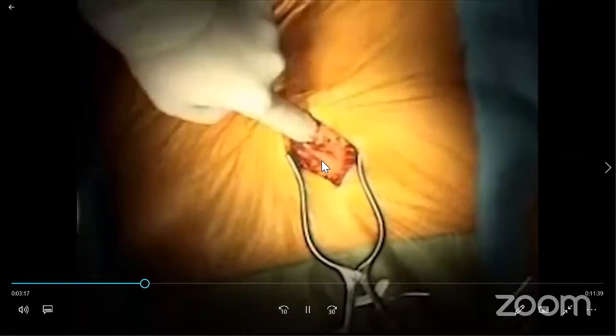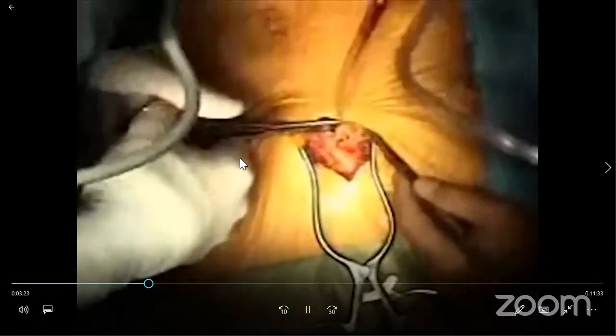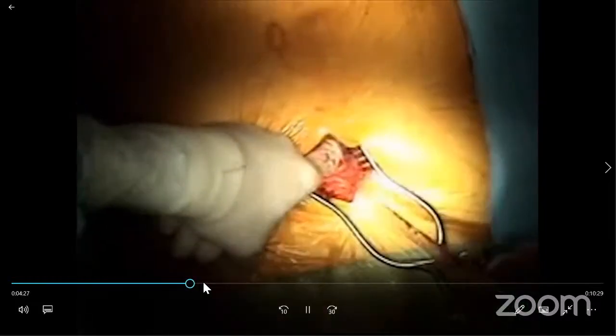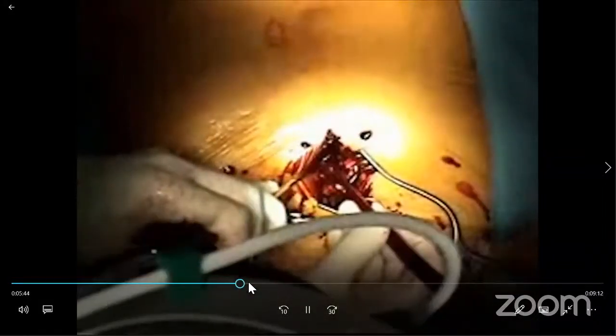Then the retrosternal space is entered by means of finger dissection of any adhesions. This is also, he is dissecting. Then the pericardium is grasped with a hook and is incised. And the opening of the pericardium is enlarged by sharp incising of the pericardium.